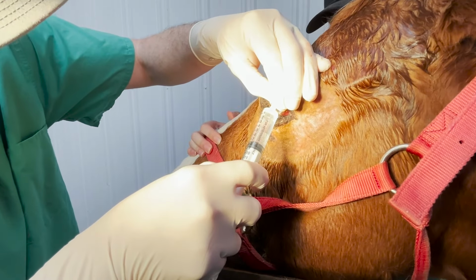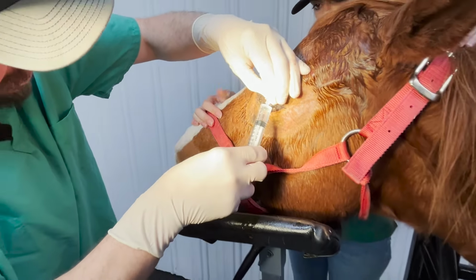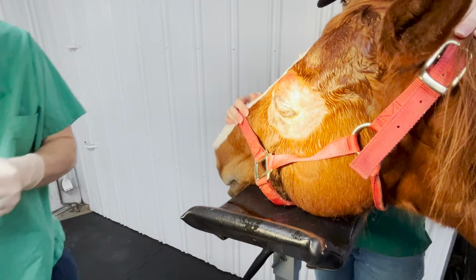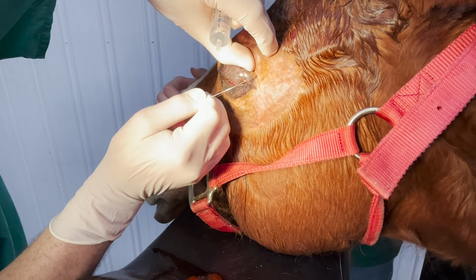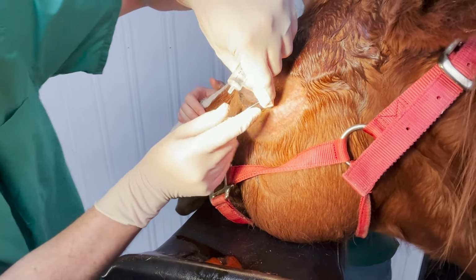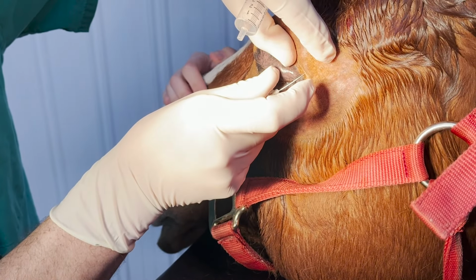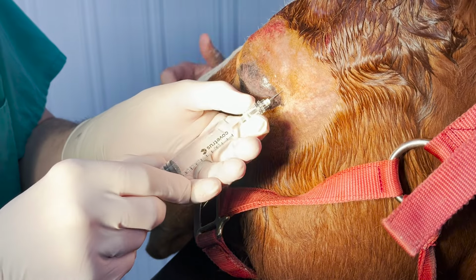So we'll fill up that structure, and it'll push the eye out just a little bit. And then we'll inject as we pull it out to numb all of that too. So we'll hit it from 4 different angles around the eyeball. Like I said, that nerve is very large back there and hard to anesthetize sometimes. So she's so cooperative, it makes these blocks way easier for us to perform.